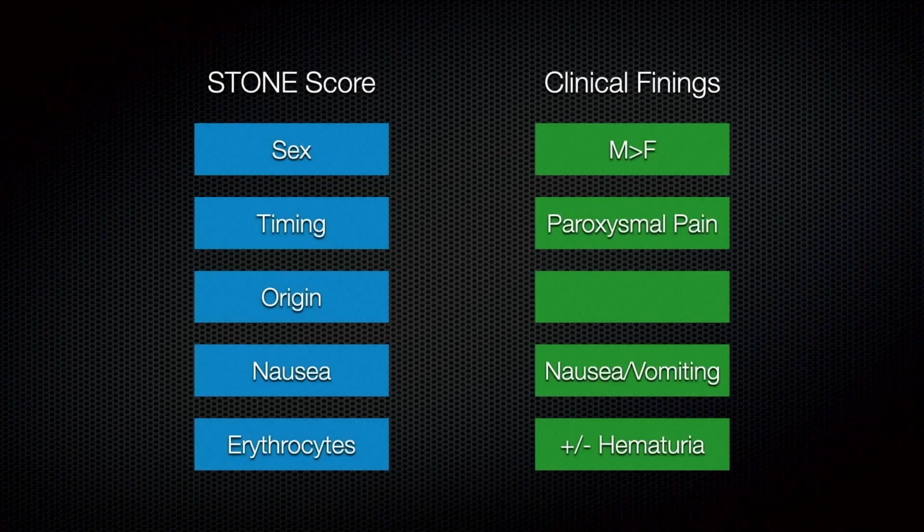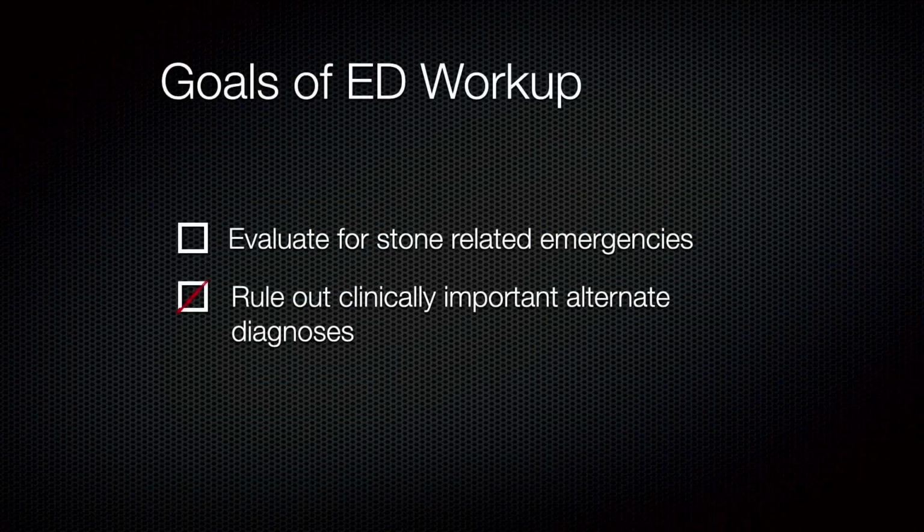And here's the modified information. So as it gets to the goals of ED workup, does it help us evaluate for stone-related emergencies? Maybe not so much. Does it help us rule out clinically alternate diagnosis? Well, it helps, but maybe not perfect.